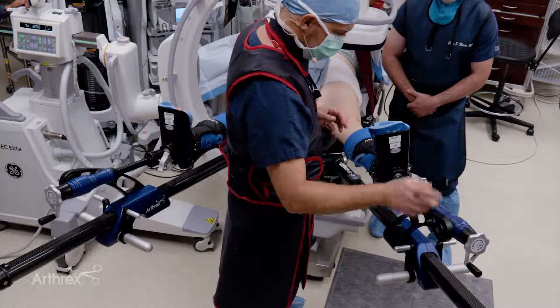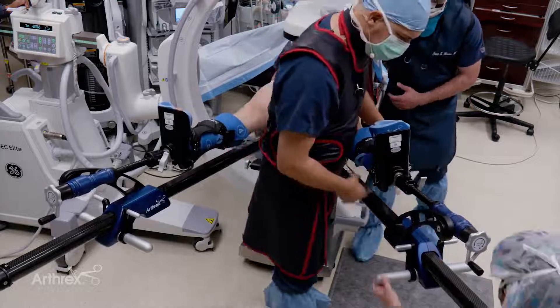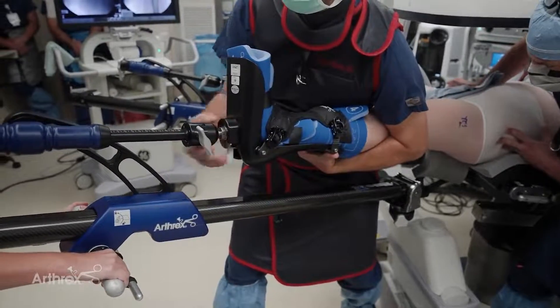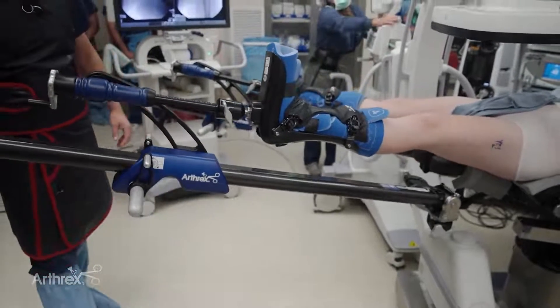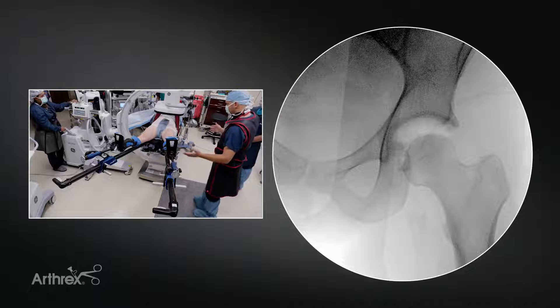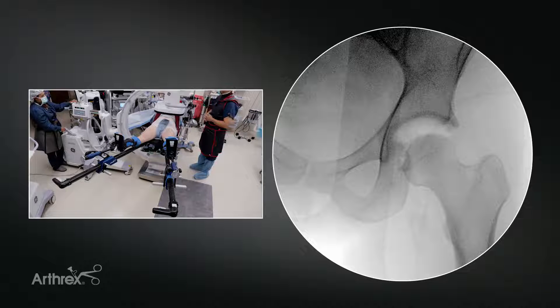A second person places the inline traction, and I like to control the leg so I can feel the degree of traction. I grab the leg and we together just gently put the hip into traction. You can see the traction that's achieved. In this case, we won't apply any fine traction, but you can apply fine traction if needed. That hip nicely came out of place with just gentle inline traction, no paralytic on board, just good relaxation with anesthesia.